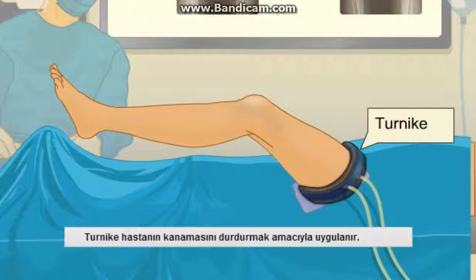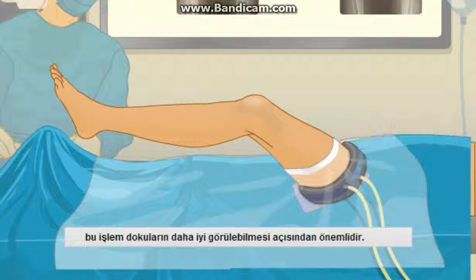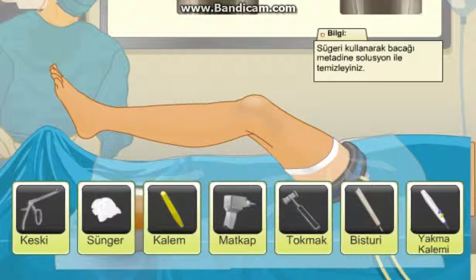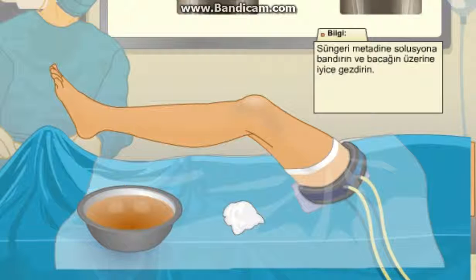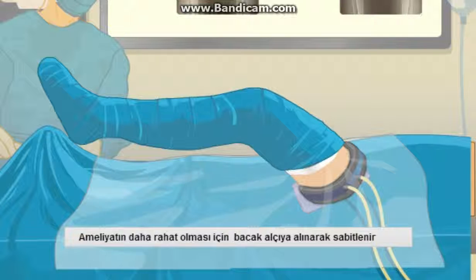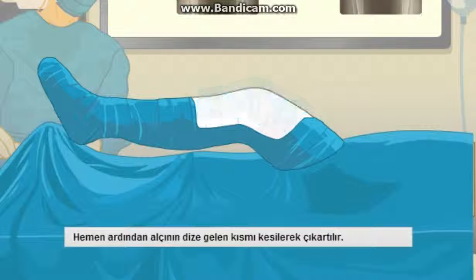A tourniquet is applied to cut off blood flow, which allows a clearer view of the surgical field during surgery. To kill the bacteria on the patient's leg, clean it in a betadine solution. This scrubbing process will limit the chance of bacterial infection. The betadine scrub is applied 2 more times, followed by the final arrangement of sterile drapes.